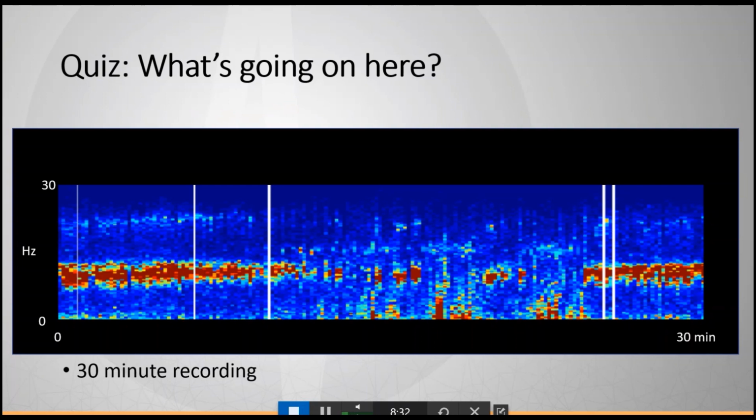Now in describing this, I'm trying not to make it completely obvious, but this is a normal sleep recording during a routine EEG. So you have the initial wake portion with the majority of the activity in the alpha range. You have the alpha dropout as they drop off to sleep, and probably vertex waves, sleep spindles in there, and stage 2 sleep, and then the arousal, and they are awake for the remainder of the study.